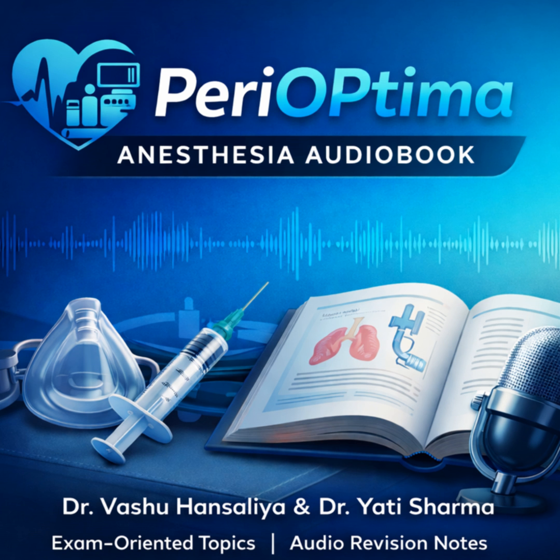Okay, that makes sense. Let's do a rapid-fire comparison round now. The kind of thing you might draw on a table in your exam answer. Right. First up, VCV versus PCV. VCV. You get a guaranteed volume, but you have unstable, variable pressure. It risks barotrauma. And PCV. PCV. You get a stable, controlled pressure, but your volume is unstable and variable. It risks hypoventilation. VCV has constant flow. PCV has decelerating flow. Perfect.